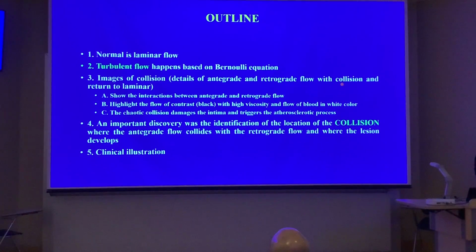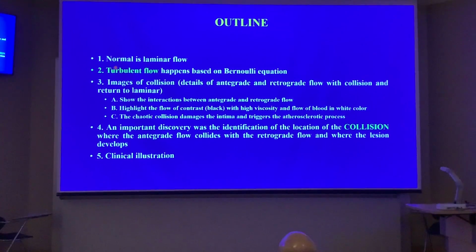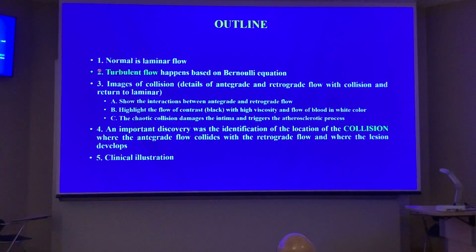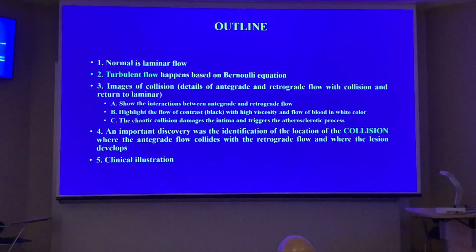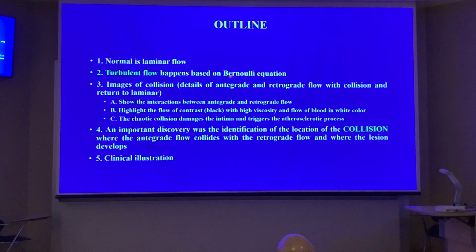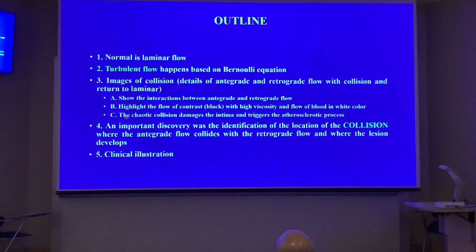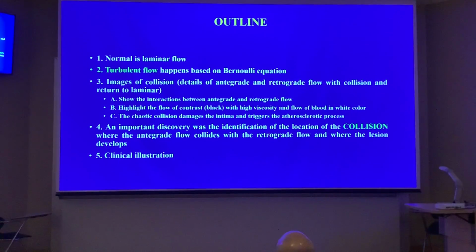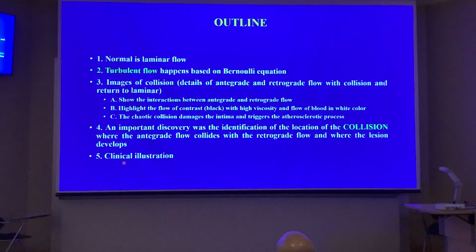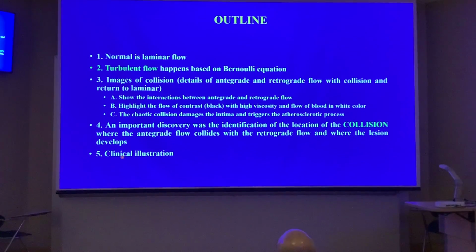For the outline, I have 5 important parts I would like to introduce. The first one is normal flow, which is laminar flow. The second one is very interesting: I will show you how turbulent flow happens based on physics phenomena like the Bernoulli equation. The third one is the images of the collision, the fourth one is the collision line, and the fifth one is a simple clinical case to illustrate.